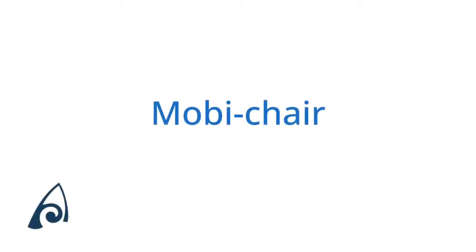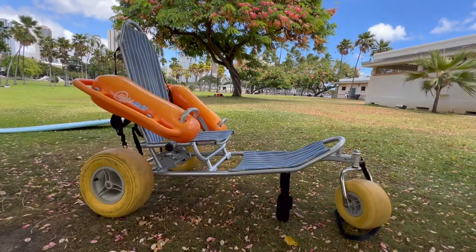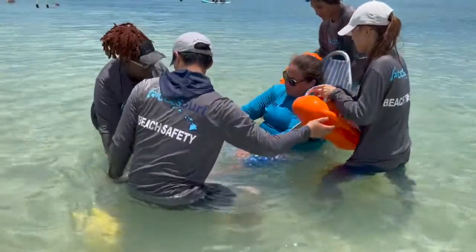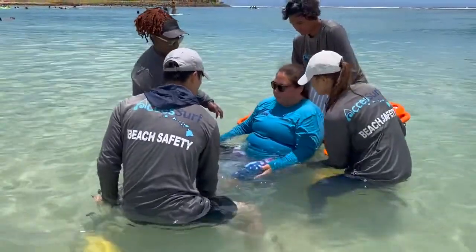The Mobi-chair is a beach wheelchair that can be maneuvered over the sand and floats in the water. It is used to help transfer participants in and out of the water. When transferring a participant in or out of the Mobi-chair, it may be helpful to first move one or both armrests out of the way.